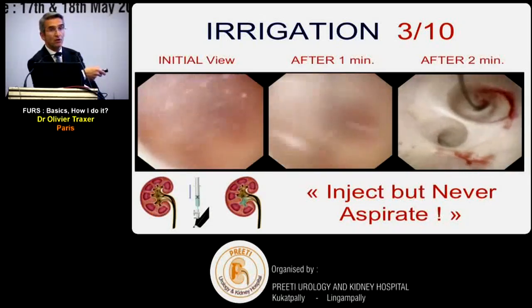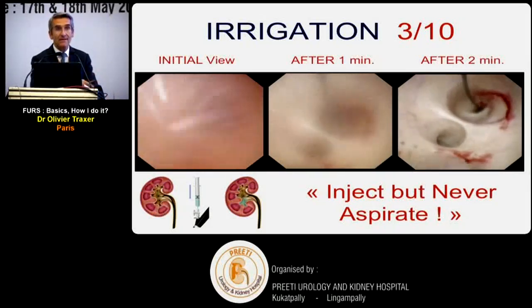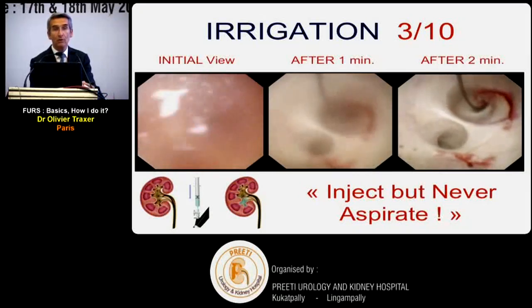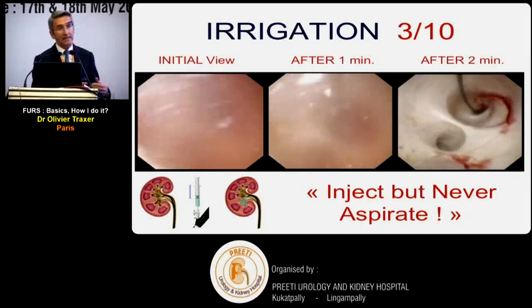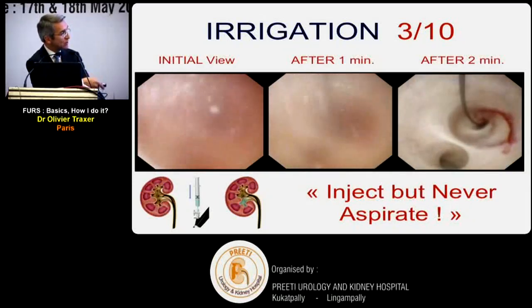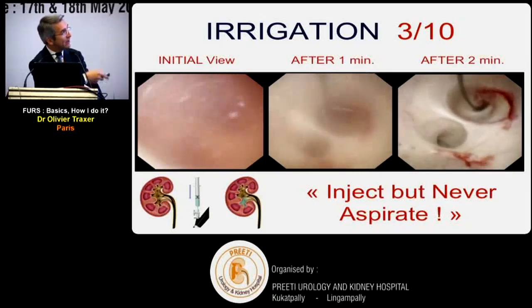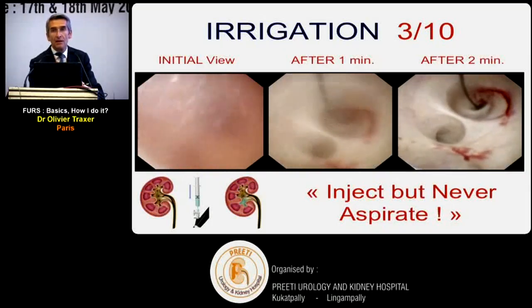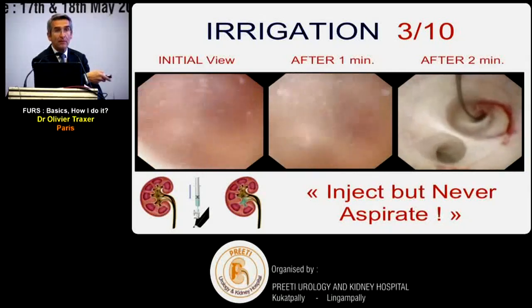When you first enter the kidney, the view shows the collecting system full of blood, urine, and debris. You can aspirate the collecting system, then irrigate again - but do it very gently; don't aspirate too fast, otherwise you collapse the system and it bleeds. The safest recommendation is don't aspirate at all - just irrigate. Take a syringe and push gently into the working channel two or three times. After two minutes, you completely evacuate the blood and urine, and the vision should be clear. There is no reason to have bleeding at the beginning of the procedure.